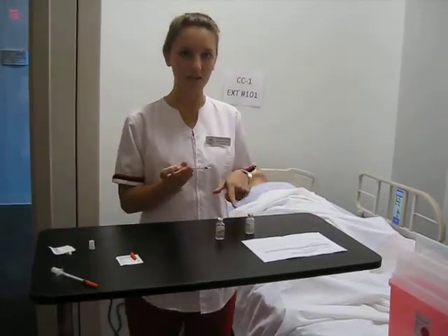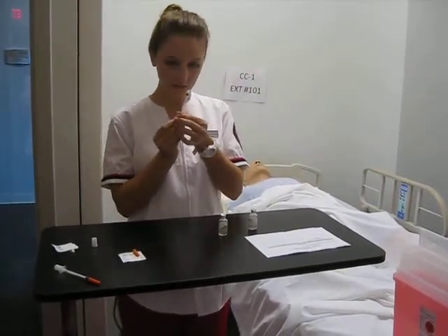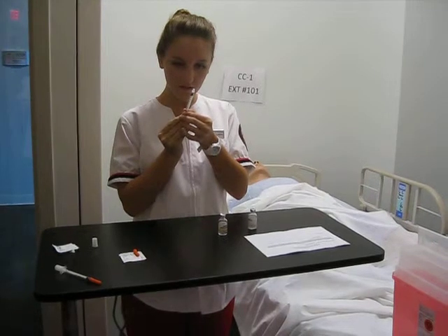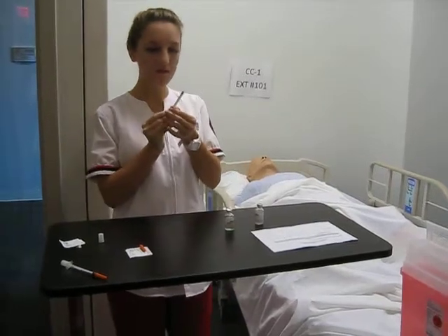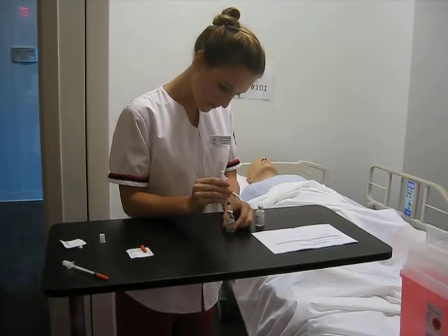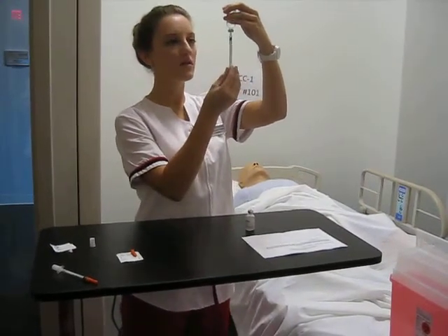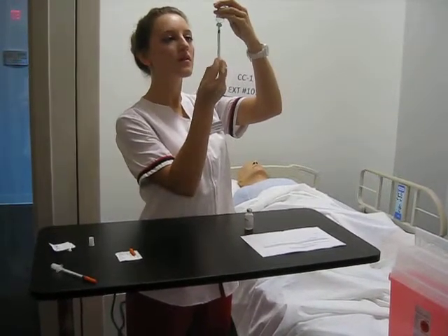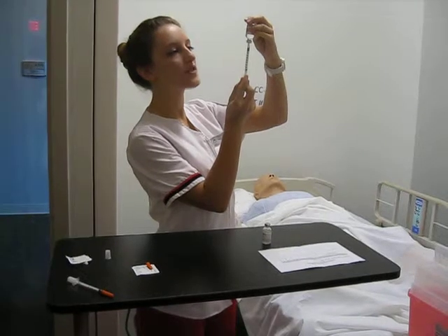I was very careful not to touch the medication with my needle. Now I need regular insulin — six units. I will put in six units of air, invert the bottle, and be very careful to take back the correct amount, which is six units.